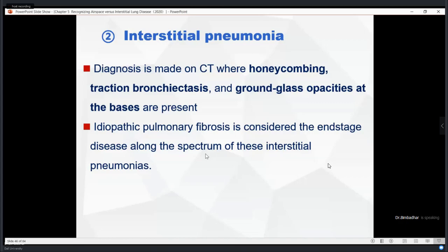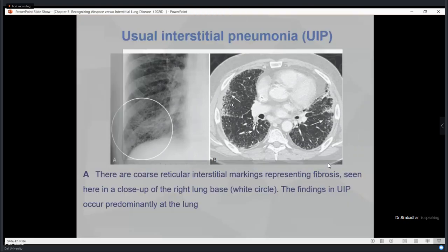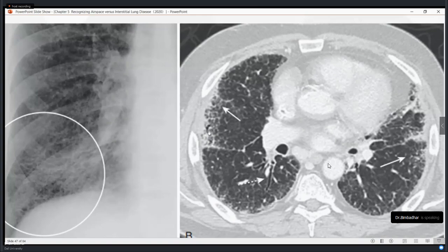As the disease progresses, a typical finding is chronic interstitial lung disease. What can we find? We can find honeycombing, traction bronchiectasis, and ground glass opacities. As simple as that. Now look at this image, at the lung peripheries, where the white arrows are marked. When you look close enough, they are so opaque. The small black spaces around this area are the bronchi, and there is interstitial thickening, and they look like an opacity there.